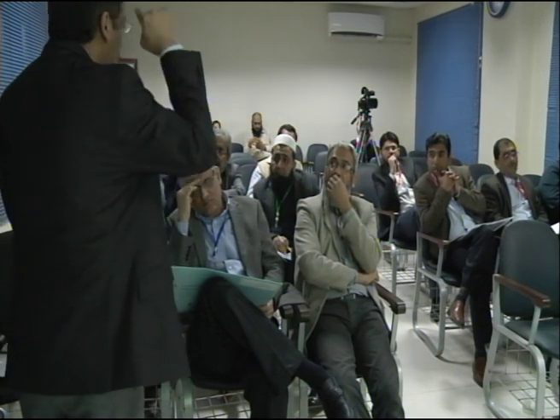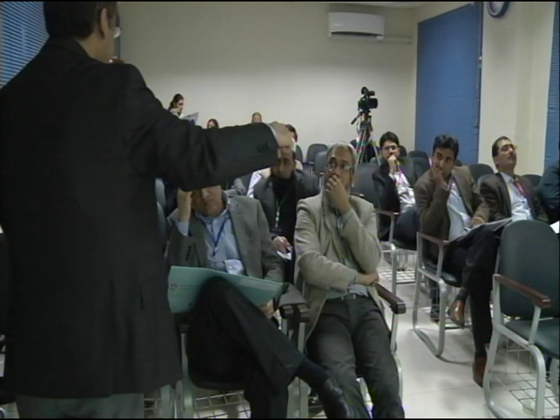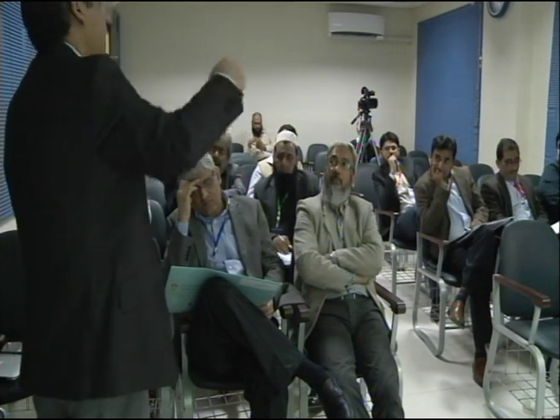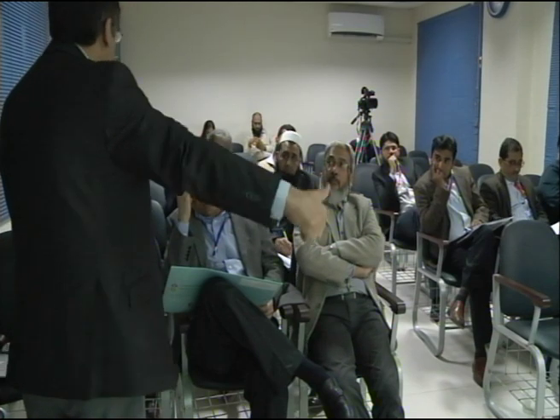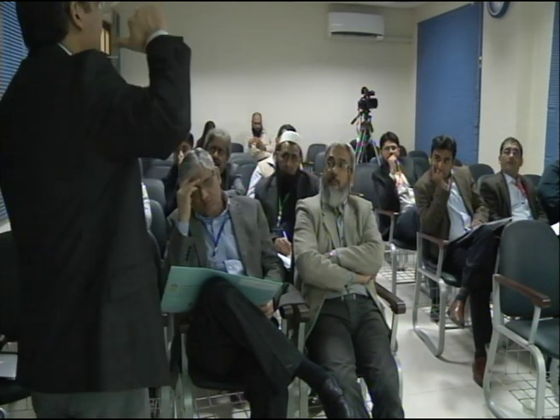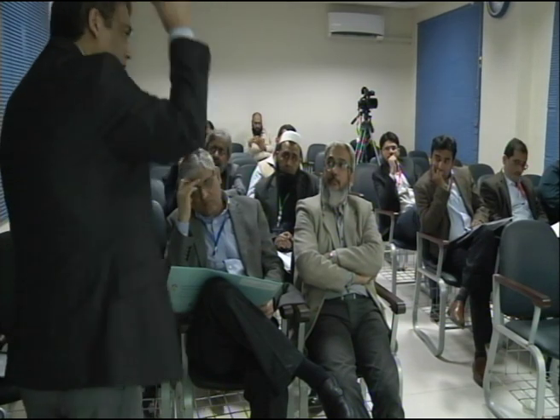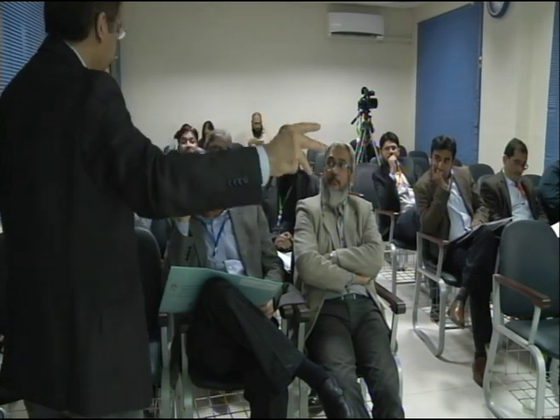First I will say, what type of patient I got? What are the patient factors which will make it high risk? Okay, it's a female, 30 years old, pancreas looks beautiful, small pancreatic duct, very high risk post-ERCP pancreatitis.